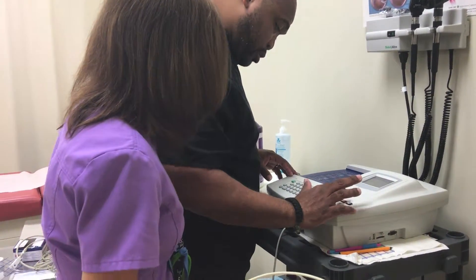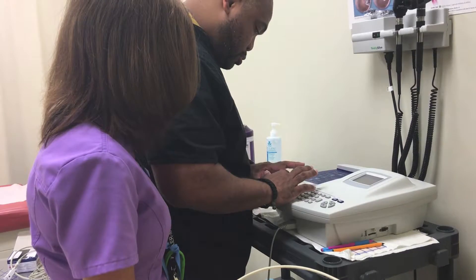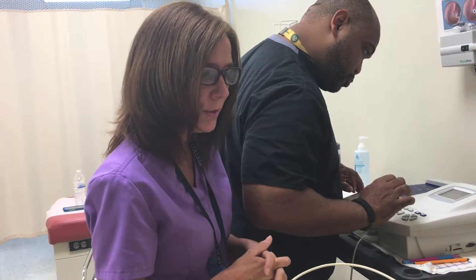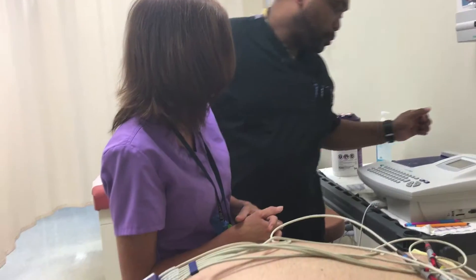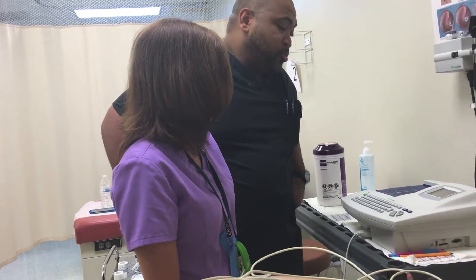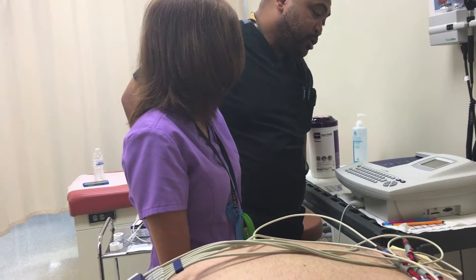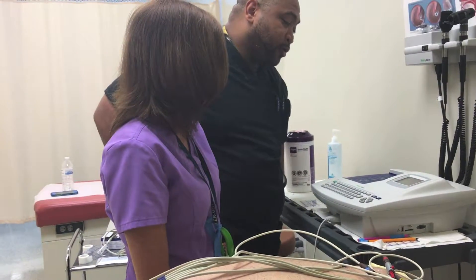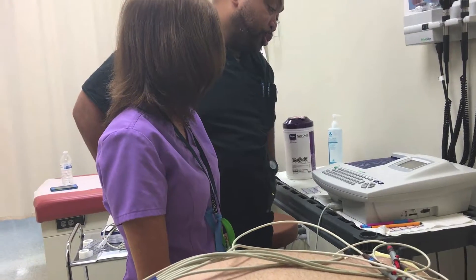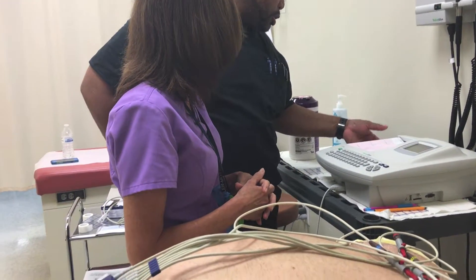We hit this button here and type in the patient name — her last name is Matthews. We're getting ready to start the machine. You won't feel a thing; we just need you to lie as still as possible. Now it is performing the baseline collection on Ms. Matthews. It's analyzing. You look very calm — you have a nice heart rate of 77. And then the machine is going to print us a report. It looks like everything is pretty good.